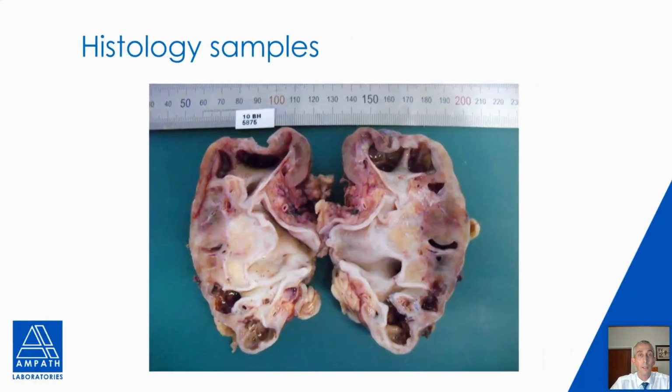Last example that I can maybe show is a nephrectomy specimen for hydronephrosis. In this particular instance, the patient presented with a mid-ureteric urothelial carcinoma, resulting in obstructive uropathy. And one can appreciate the dilatation of the renal pelvis and the calyceal system. This was a non-functioning kidney, which was also removed during the nephroureterectomy procedure.